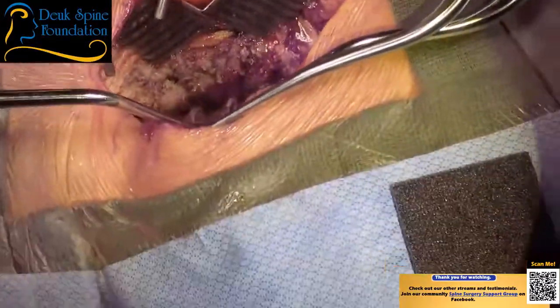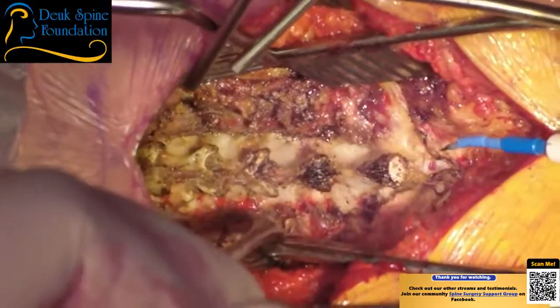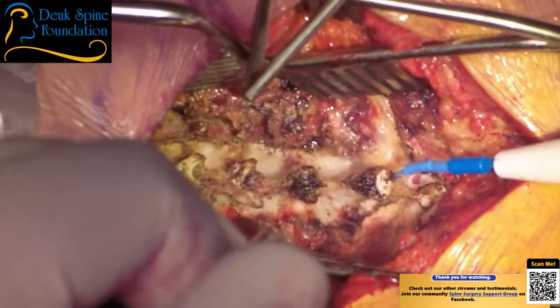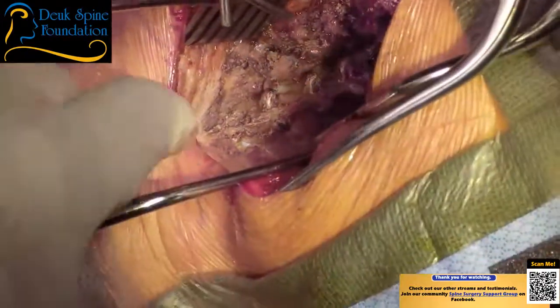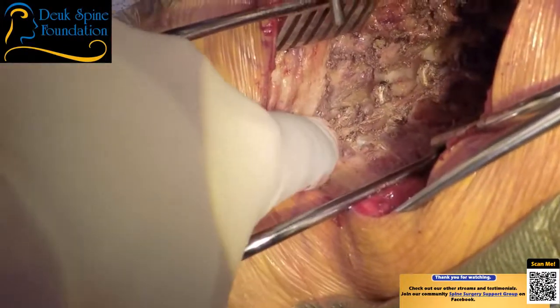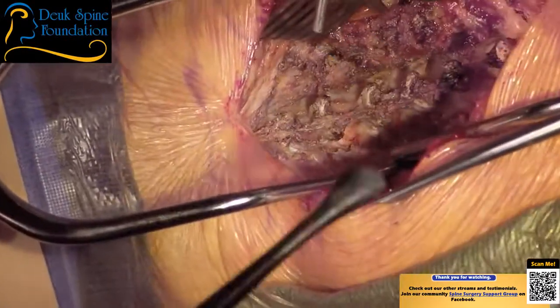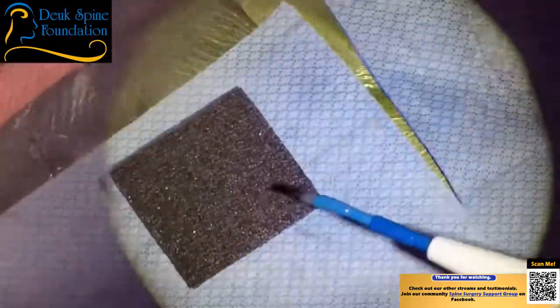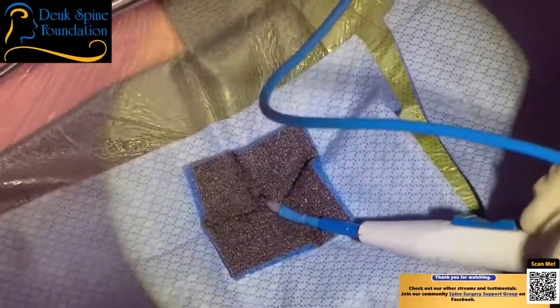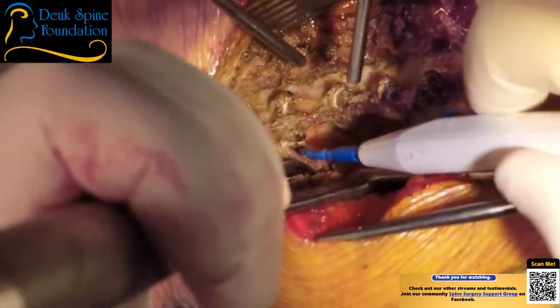All right, you seeing what we got here? Okay, so if I had to guess, that may be T1, 6, 5, 4, 3. We're getting close to 2. So I don't feel anything here. This has got to be C2 right there, is what I'm thinking. I'm not going to take any more of the muscle off C2 at the top. I'm just going to stay at the bottom.